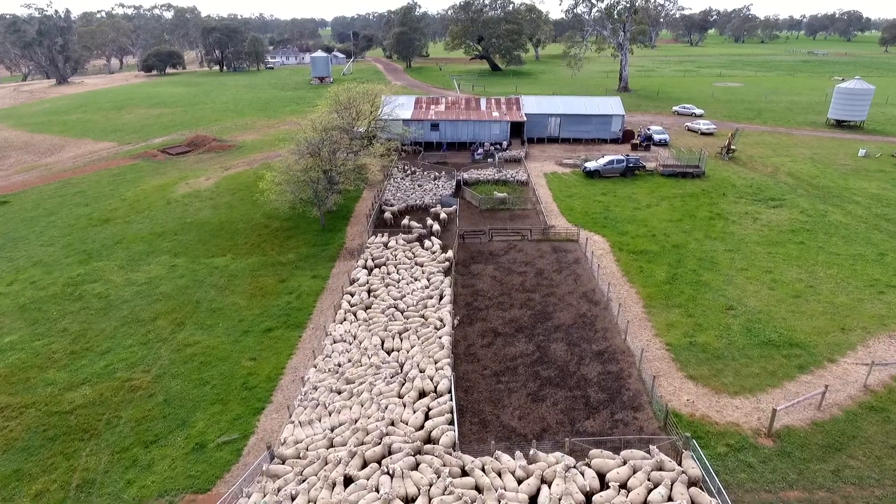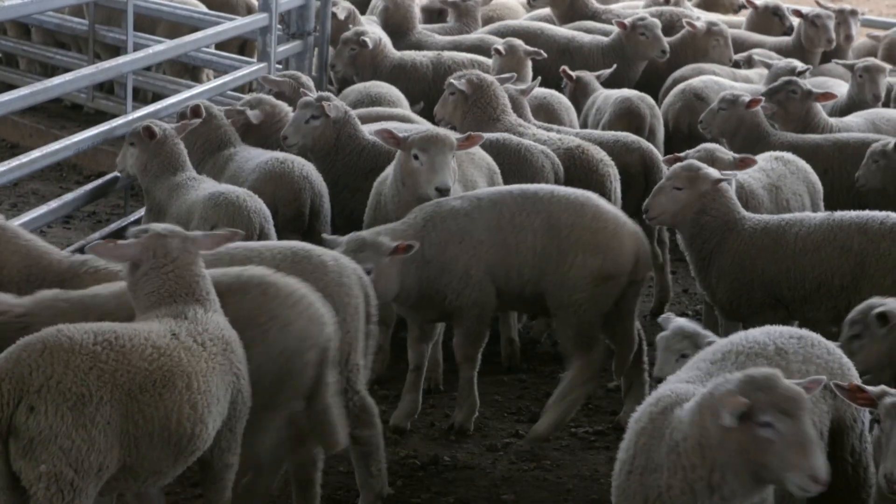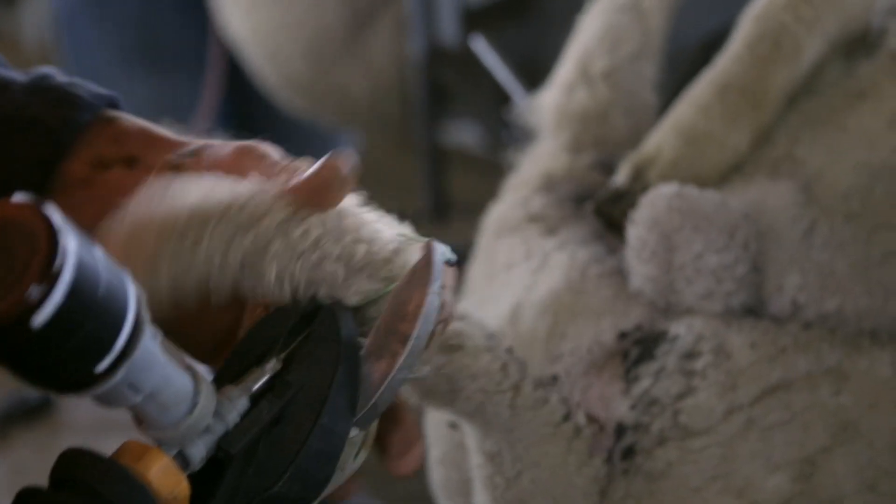My name is John Ritchie. I'm a design engineer with 4C Design in Scotland. We were first asked to look at a solution to pain animals experienced during the necessary husbandry procedures of tail docking and castration.